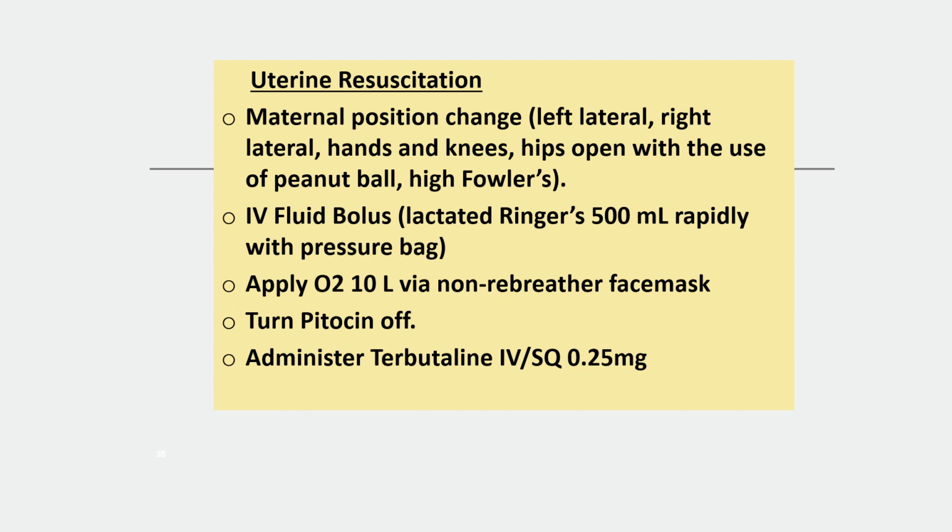Because really what we're doing with uterine resuscitation is we're trying to allow her to labor to get to complete and have a vaginal birth. So we're trying to improve how the strip looks to get her there, to avoid cesarean. But we may not be able to do that in every case. We have to ultimately end up doing what's safest for the baby. So that's kind of what we're doing.